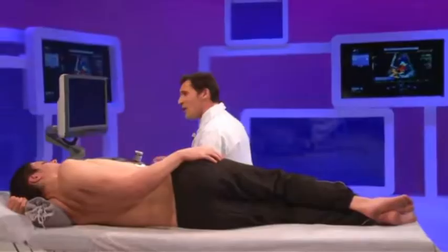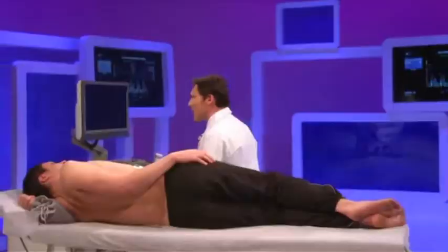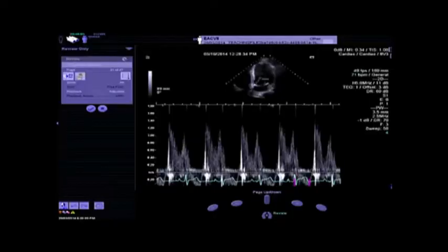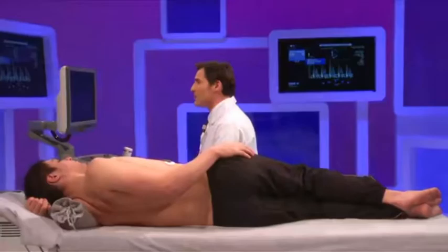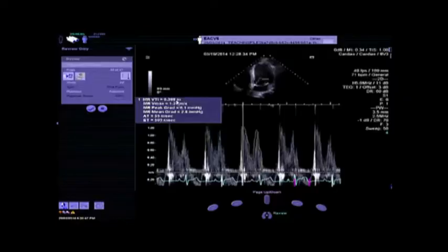I will switch on the Doppler to analyze the mitral inflow. And here you have the mitral inflow in these patients. And we just need to measure the VTI. And we have the VTI. We have also the velocity. And you know when the E velocity is above 1.5, this is in favor of severe mitral regurgitation. It's a semi-quantitative sign or parameter. But in this situation, we have 1.2, again in favor of moderate to severe mitral regurgitation. But importantly, what we can assess is the time velocity integral, and you have the measurement here.